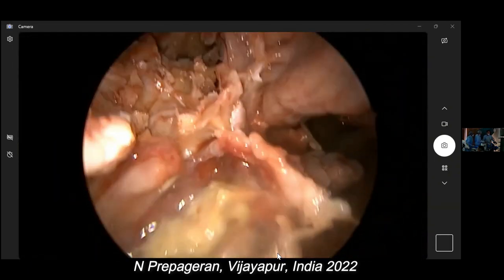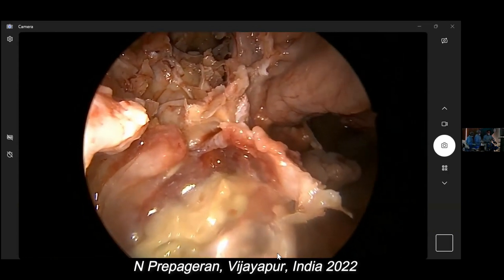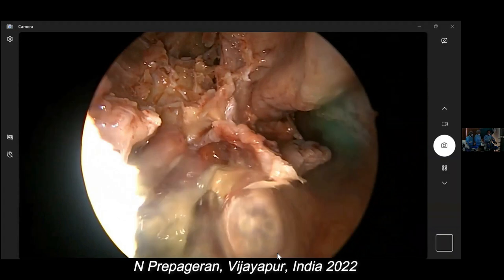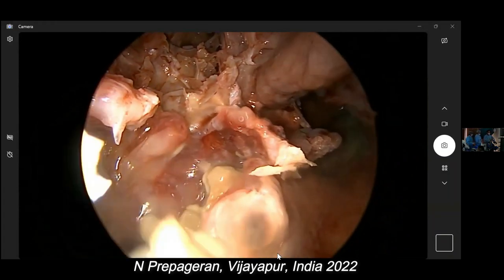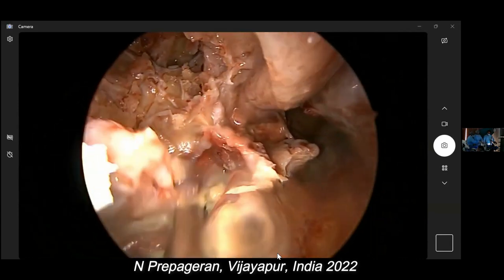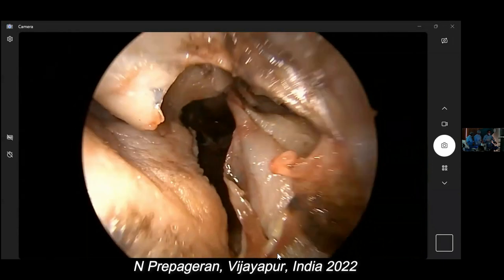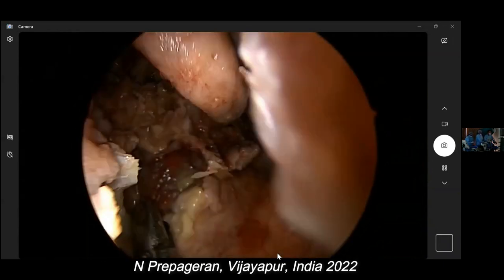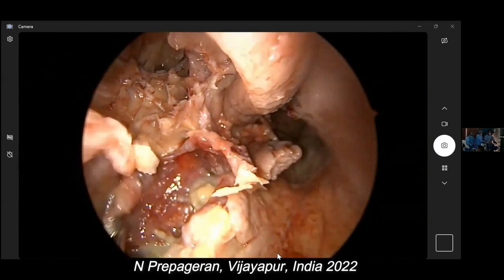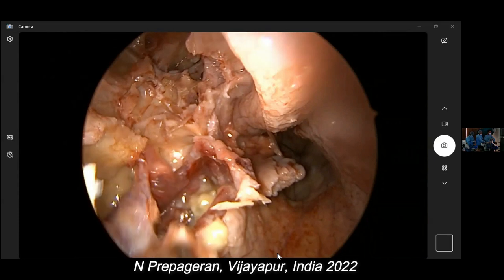We've got a lot of stuff inside here. Can you suction first? Suction is on there. You have suction? Oh, no, give me suction separately. And give me a Blakesley as well. So now I'm going to remove the mucosa of the posterior wall of maxilla. Okay, can you see, guys? The entire mucosa is coming out.